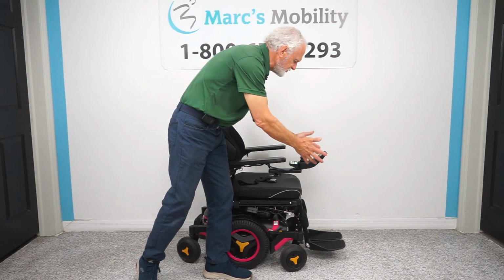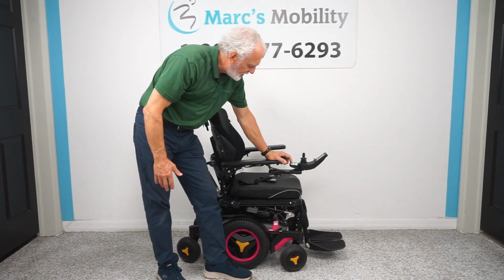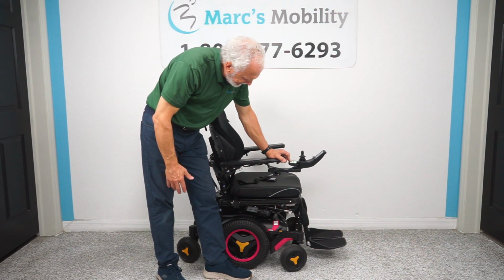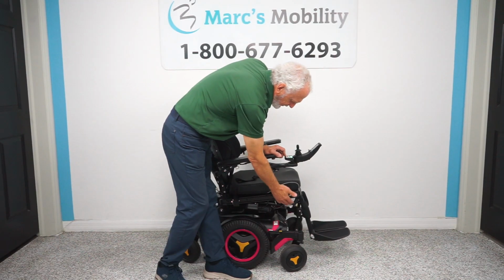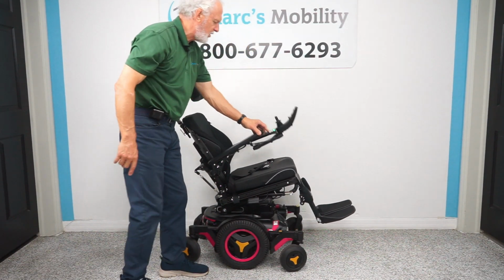So you can do those functions always through the joystick, but I'm going to use a little switch box that's quicker for me. So if I push the button down, you'll see the seat will start tilting back. Tilting means the bottom goes back, okay? So of course it's going to take the legs and the back as they're all connected.